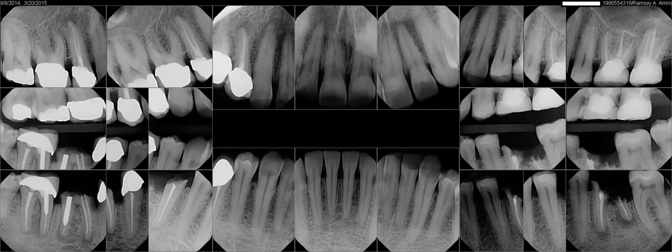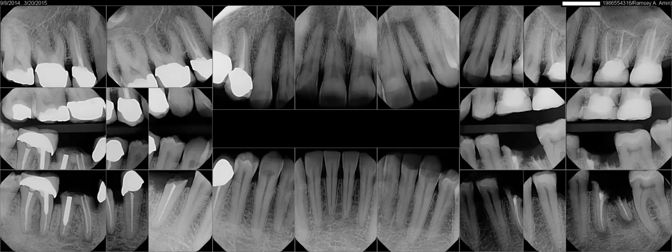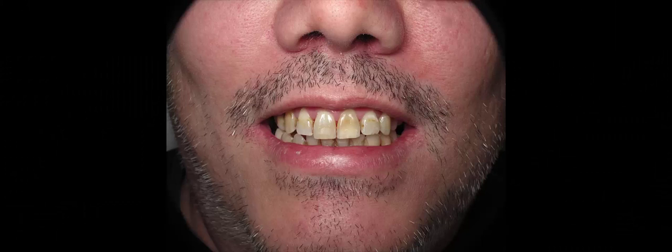You'll see along the way this patient loses these upper crowns that have some problems in the root canal area, some infection or inflammation, and this tooth will actually fall apart along the way. You can actually see at a later date that that tooth broke off also. Not all teeth should be saved.